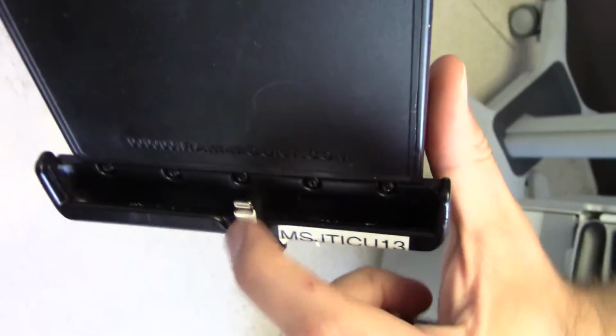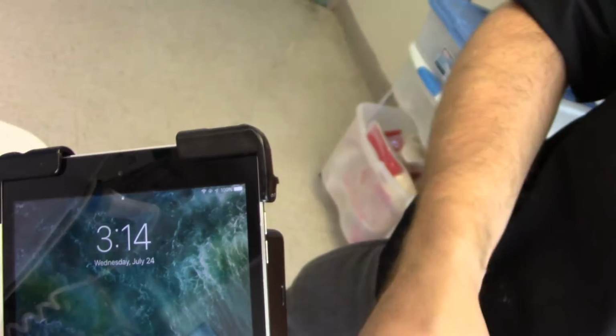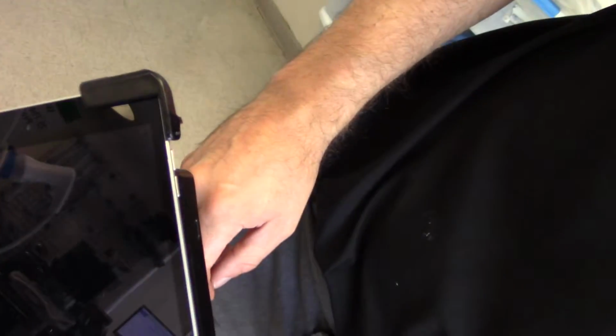So when it's sitting in the dock, okay, so that's probably just a tightened clamp. Yeah, there's a clamp right there. Okay, so all you have to do is slip it back in. Correct. And so you just slide it back in. There's a little lever on the back that latches it back in place. All right. And then we lock it.